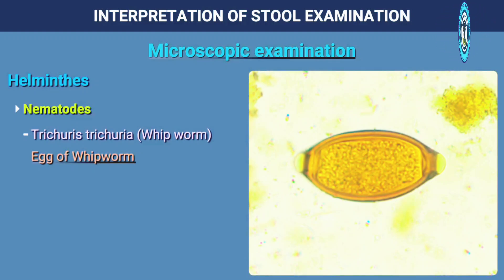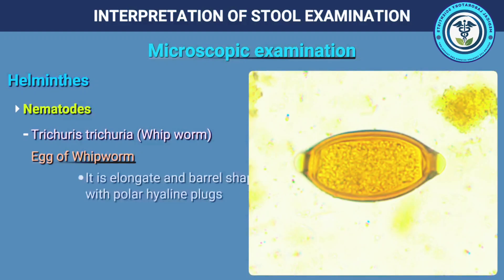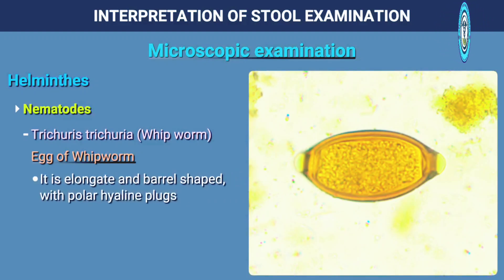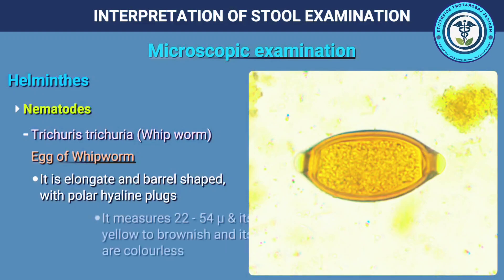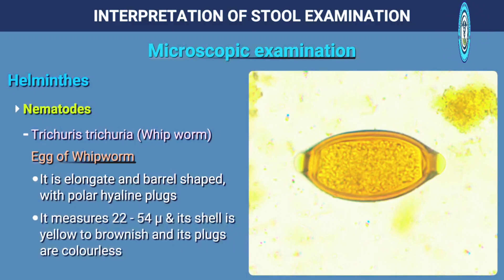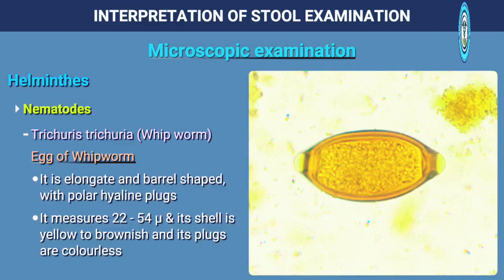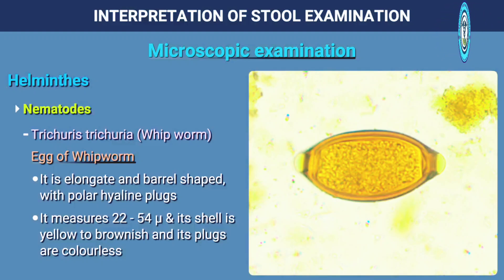Trichuris trichiura, or whipworm: the egg is elongate and barrel-shaped with polar hyaline plugs. It measures 22 to 54 microns and its shell is yellow to brownish while the plugs are colourless.